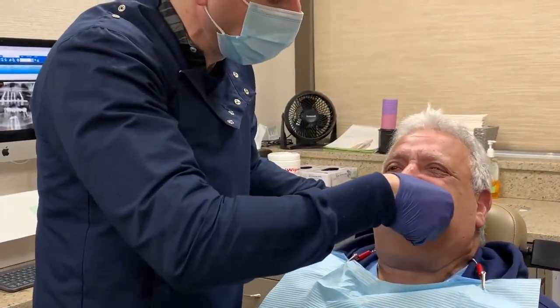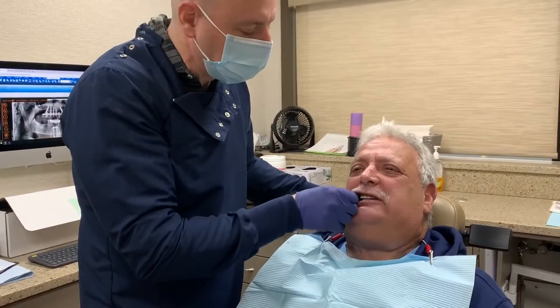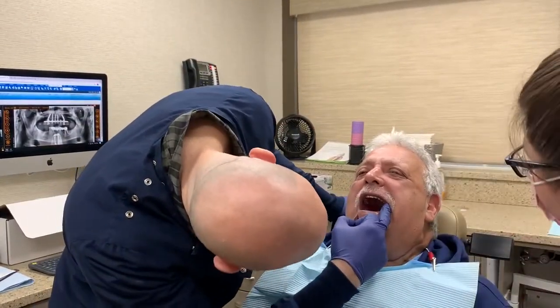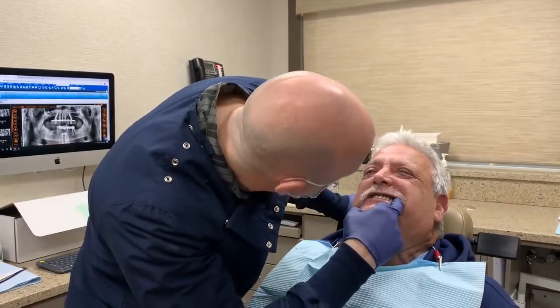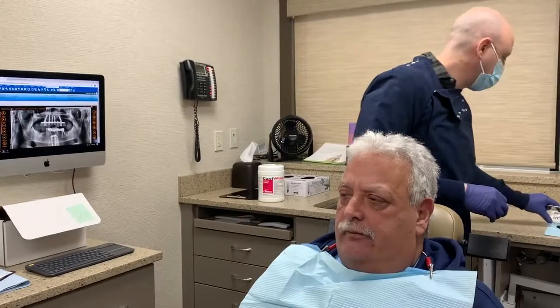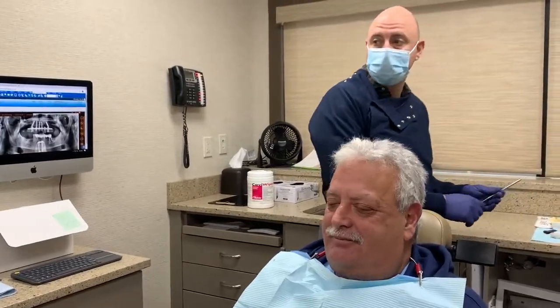And bite down. And open. And bite down. And open. Okay. And bite down again. Okay. And open. Okay. So what I'd like to do in this scenario is I'll just adjust it intraorally.